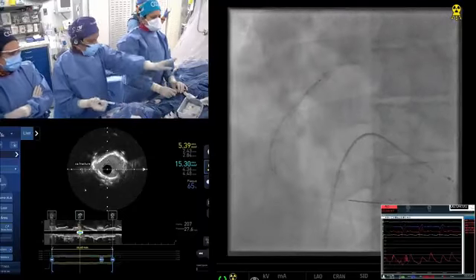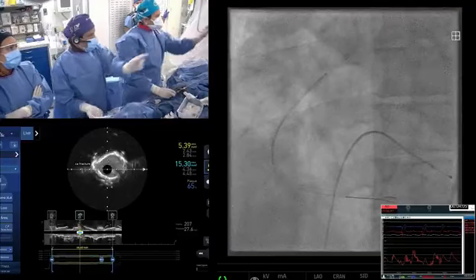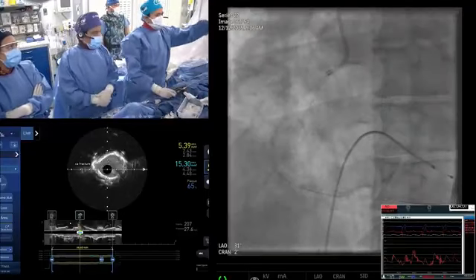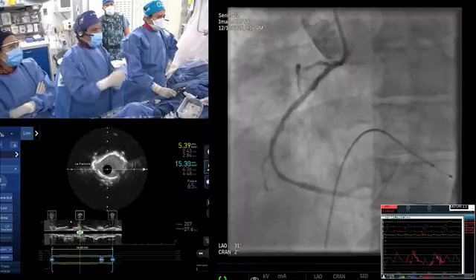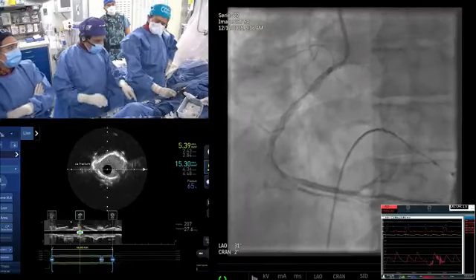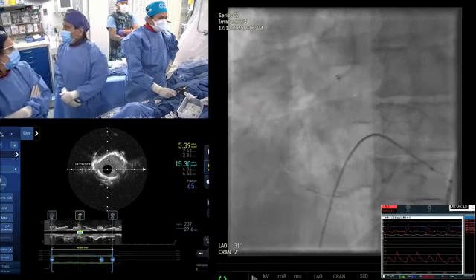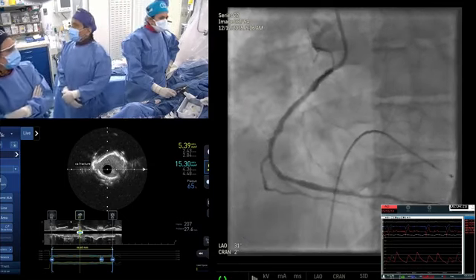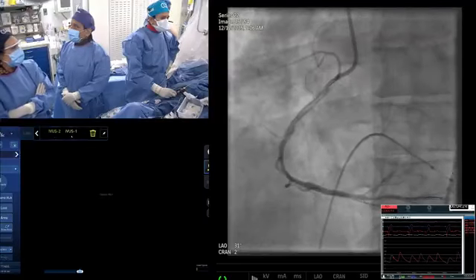Okay, let's see whether that area has disease or not. It's not. No, your angiogram. Yeah, here. See, there is a disease there. If need be, you do one more proximal if required. But I'm saying this is good. Go touch the second lesion. I mean, why would you not touch the second lesion? We should not do a full metal jacket. That's okay. That area is okay. There's no other branch.